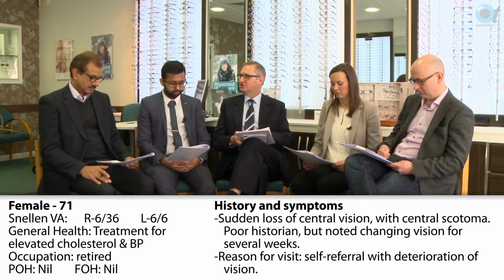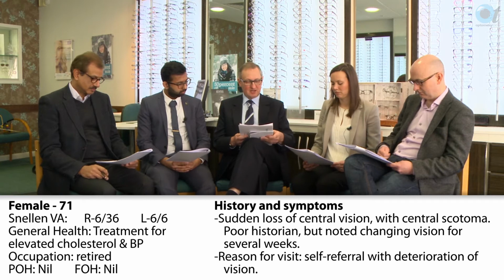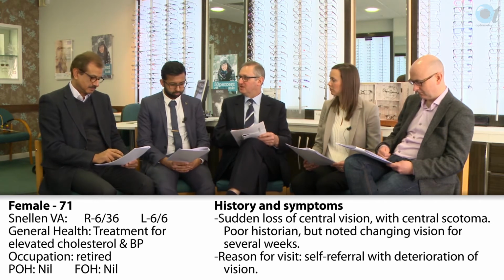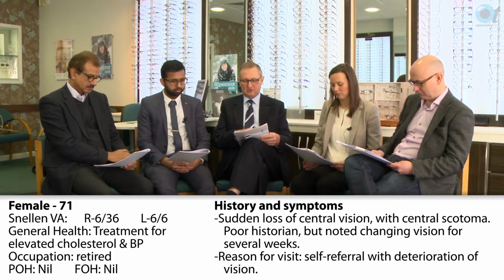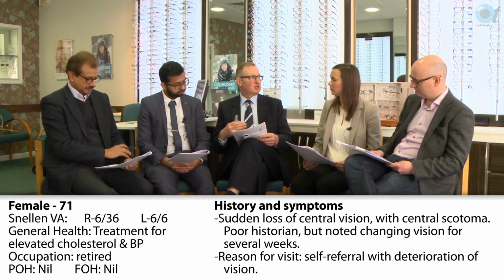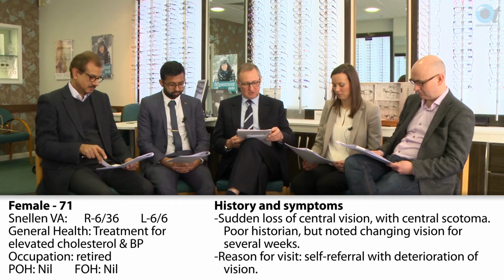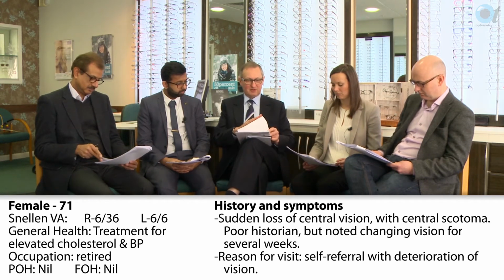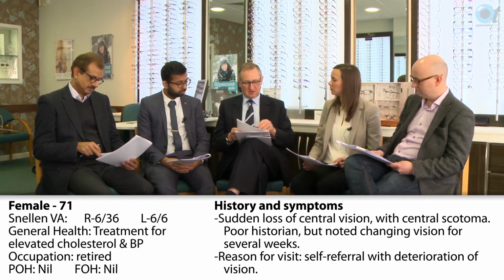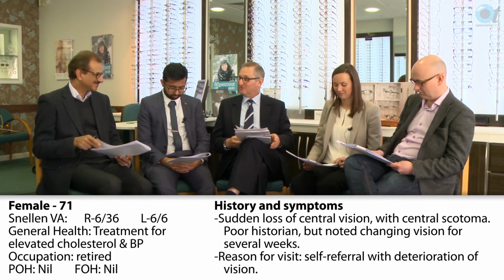In the clinic, she measured 6/36 in the right eye with 6/6 in the left eye. We were unable to get IOP measurements for her, and she reports that although the loss was sudden, she'd noticed it change over the last few weeks. So she hadn't seen anybody else about this problem, but she would like your opinion as to what's going on.